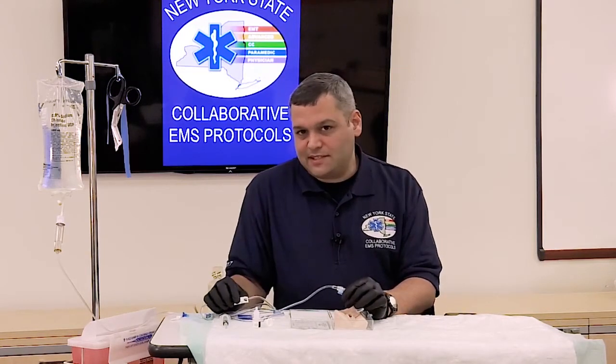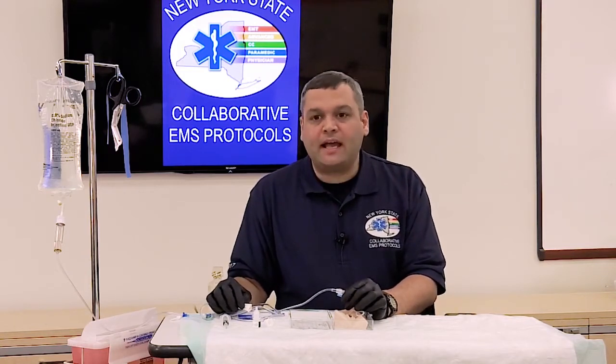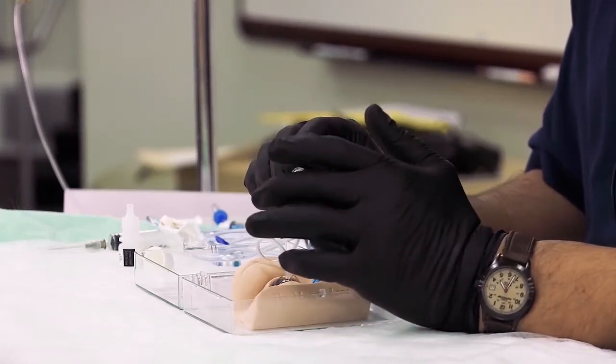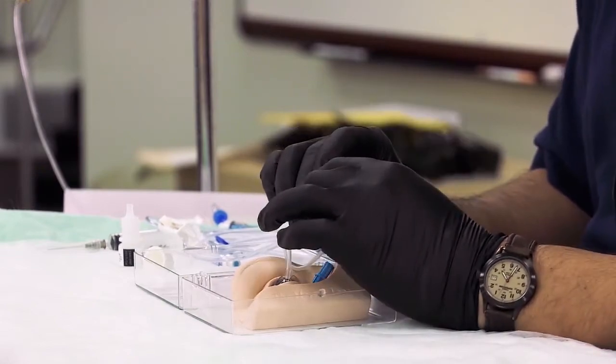One of the issues is that the Tetracaine unfortunately doesn't last very long, so we're going to have to reapply it. But it can be difficult to instill the Tetracaine with the lens in place because the lens occludes essentially the entire sclera.